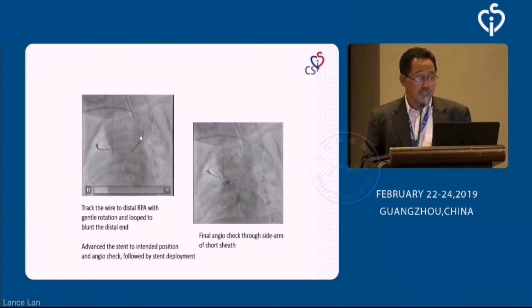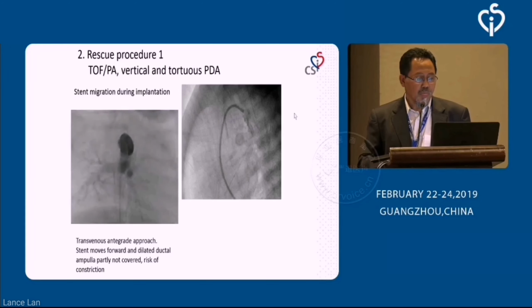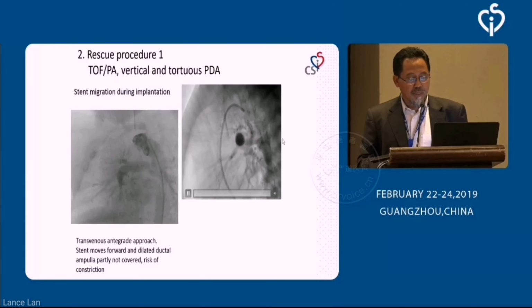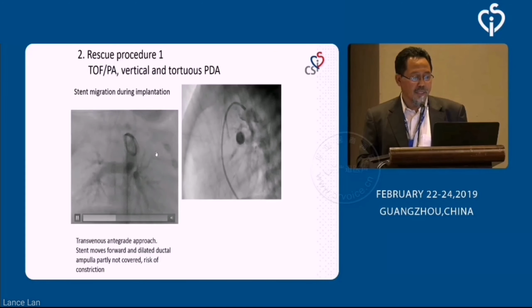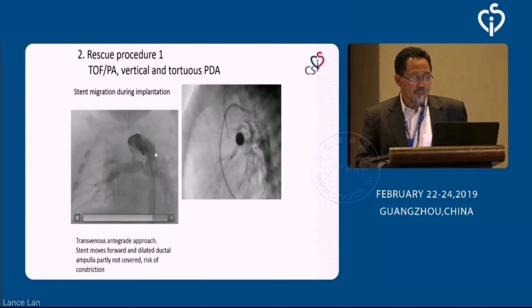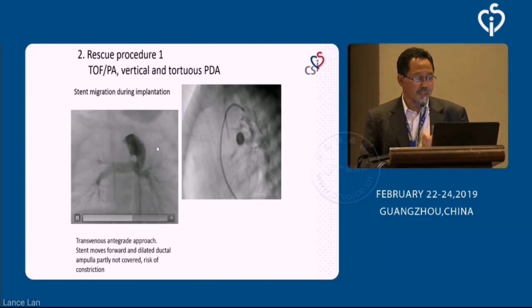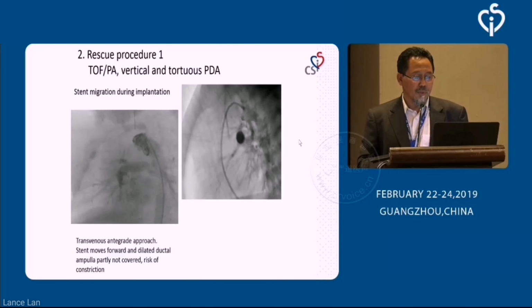This is the same case I showed to you, the abnormal vessel supplying the right upper lobe, a sequestrated lung, with an aberrant right subclavian artery arising from the descending aorta, successfully stented. What about rotational angiography? Whether that's able to give you a better idea, I don't think so. I prefer pre-procedure delineation of anatomy, so that we can perhaps directly puncture the next vessel for the route.